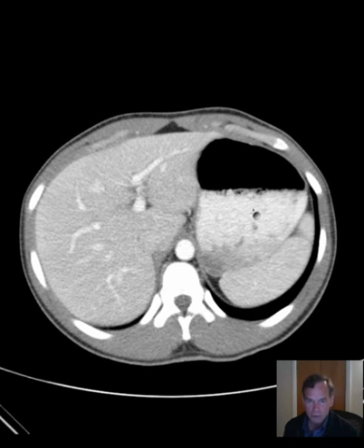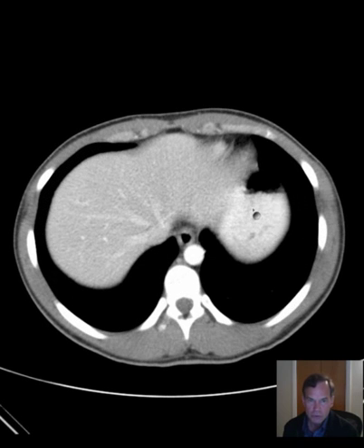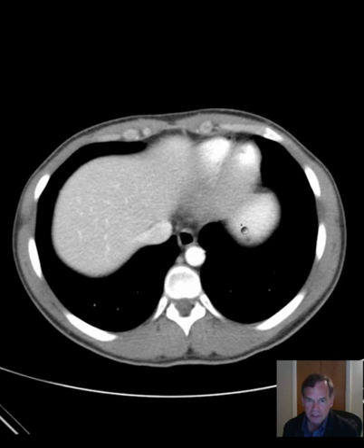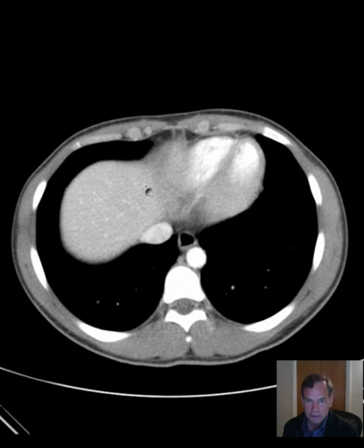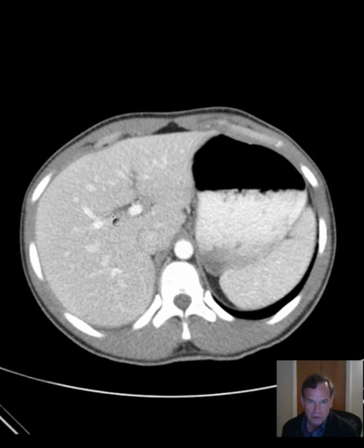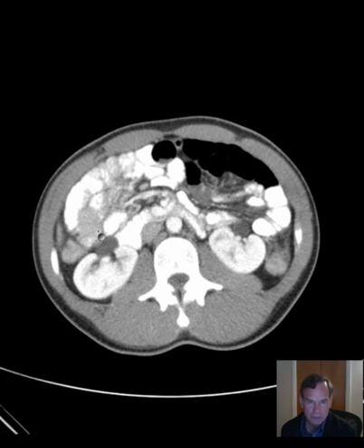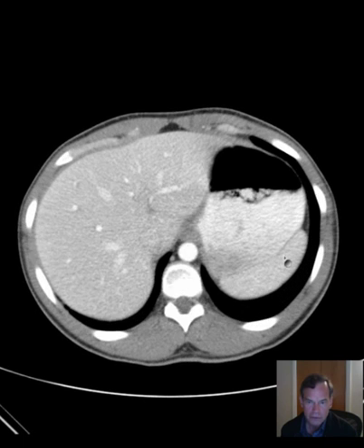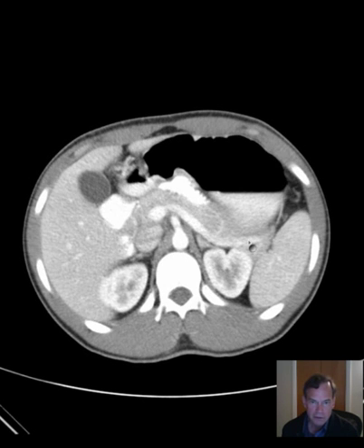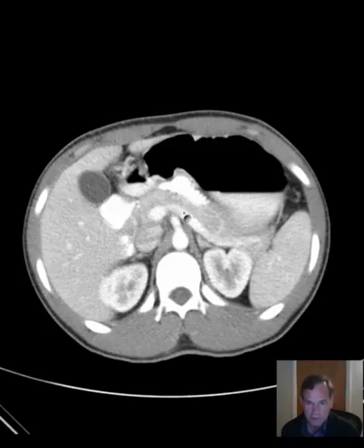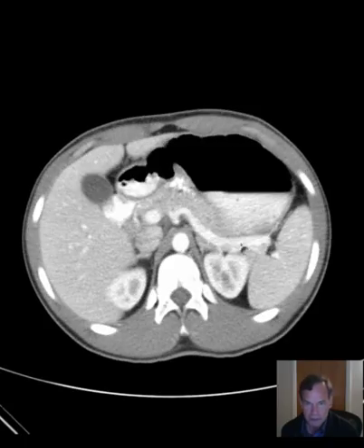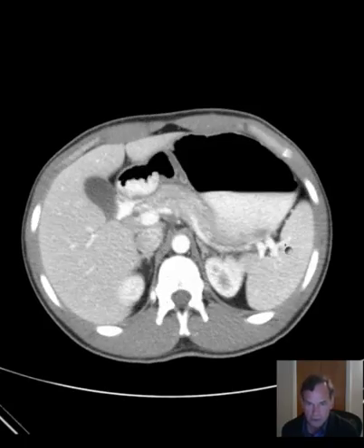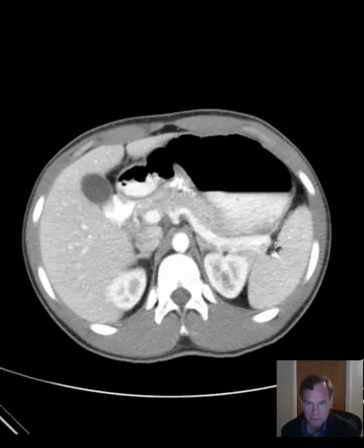But first let's go through our routine and make sure we examine all structures in the abdomen, and that includes the liver, spleen, and pancreas. So we go through the liver, look through every image, spleen, all the way through the spleen, and the pancreas. Here you can see the pancreas being closely followed along its posterior aspect by the splenic vein, and the splenic vein goes to the splenic hilum, always.